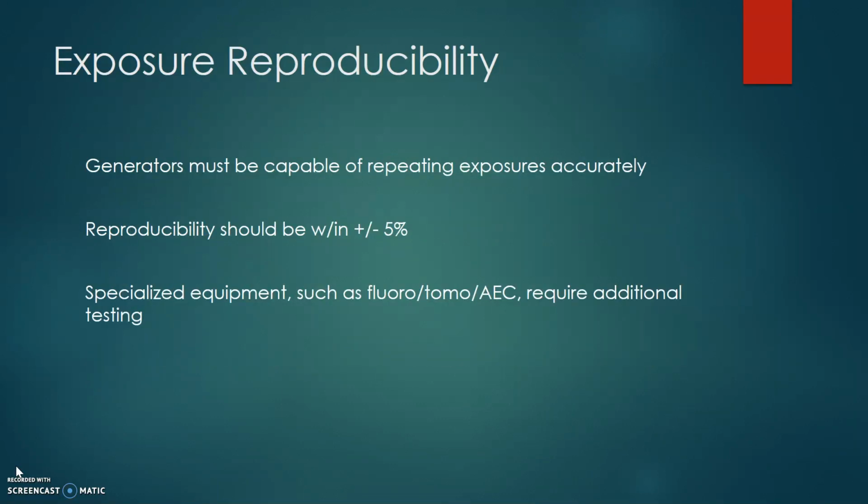Generators must be capable of repeating exposures accurately, also known as exposure reproducibility. Reproducibility should be within plus or minus 5%. Specialized equipment such as fluoro, tomo, and AEC require additional testing.